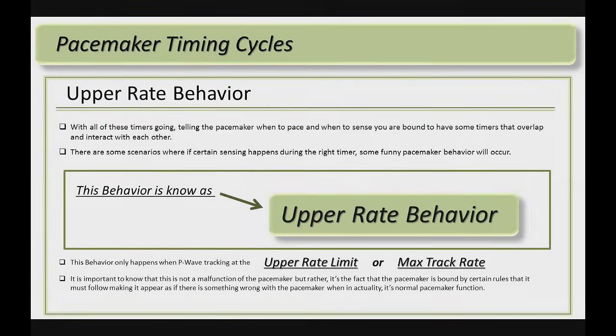It's important to know that this is not a malfunction of the pacemaker, but rather it's the fact that the pacemaker is bound by certain rules that it must follow, making it appear as if there is something wrong with the pacemaker, when in actuality, it's normal pacemaker function. The trick is to program the pacemaker to minimize any upper rate behavior.